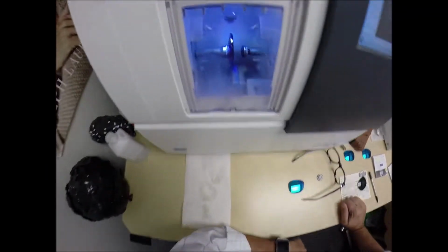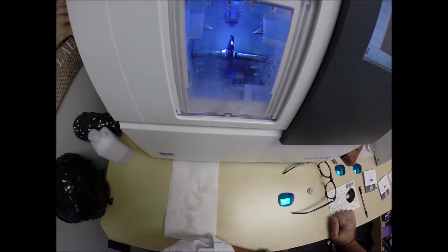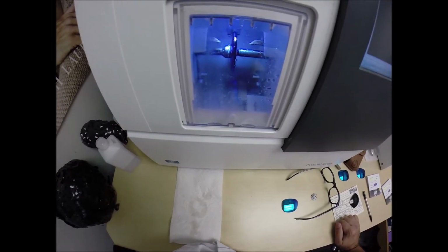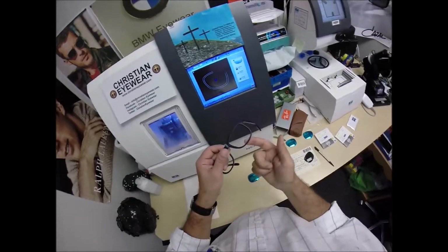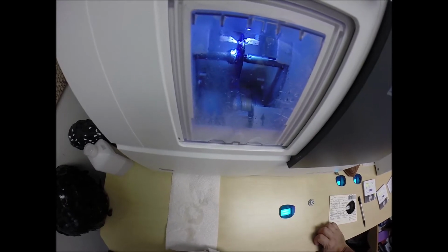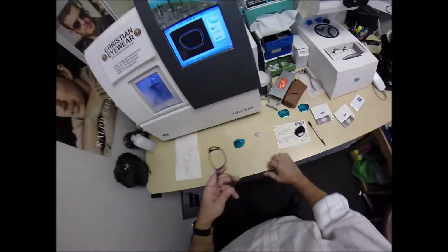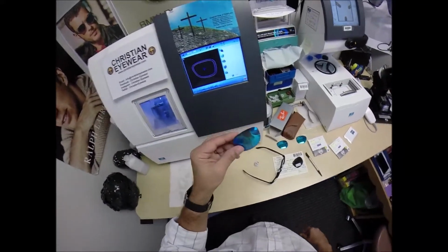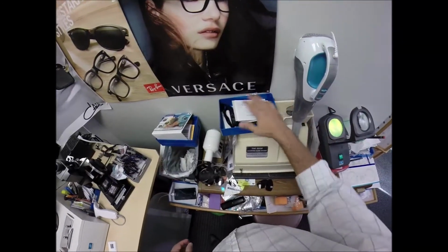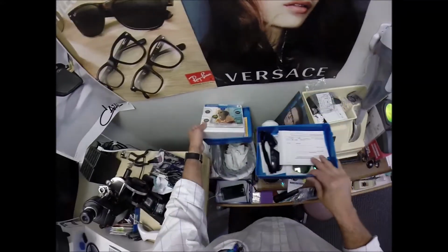Just like before, the door closes, the clamp shuts, the lens is going to be traced by the two white styluses, making sure that it's large enough to fit into the left side of the frame. And you can see as it's going around tracing the shape. And then measuring the thickness of the lens to know where to place the bevel so you have the least amount of edge thickness showing, of which I can't show you yet because I'm going to go old school. Let me flip this over so there's no confidentiality stuff there.